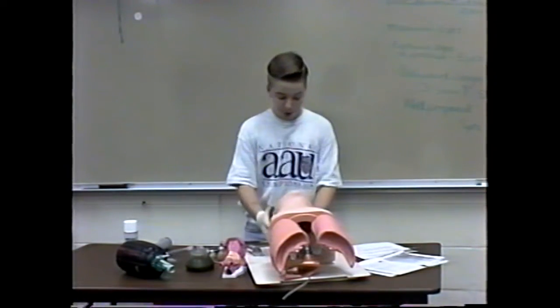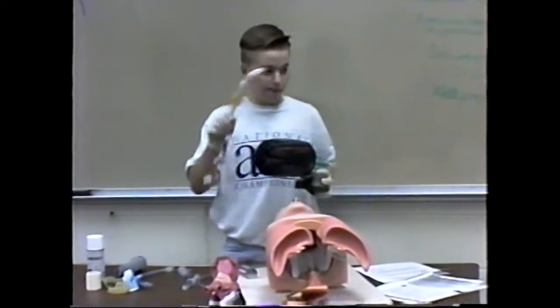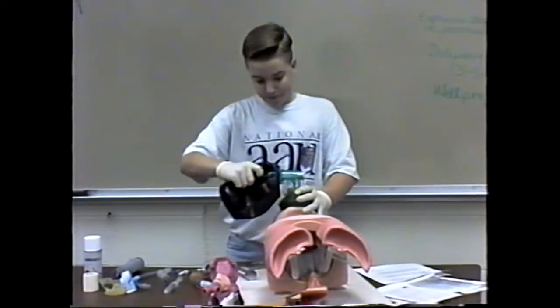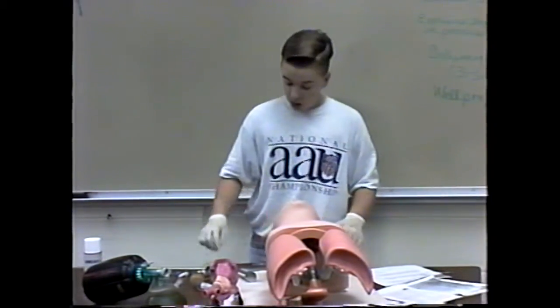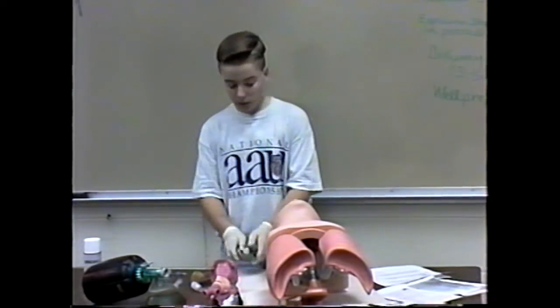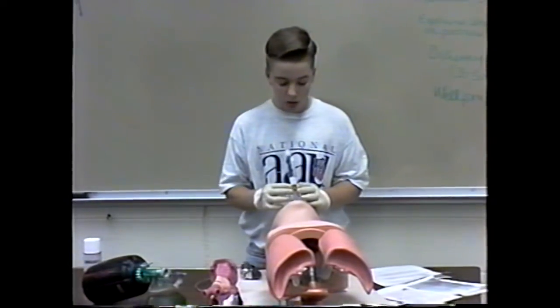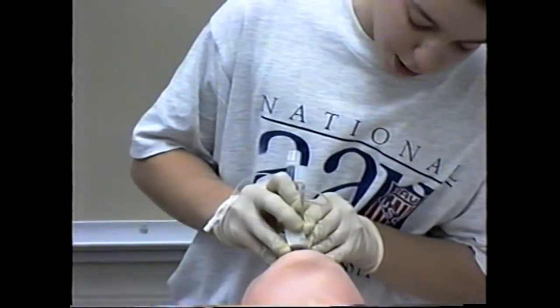When inserting the combo tube, again, you ventilate the patient. You tilt the head to the appropriate position. The combo tube is inserted blindly. You don't use the laryngoscope. You can see there are two little lines on the tube, and the top teeth should be in between the two lines or on the top line.